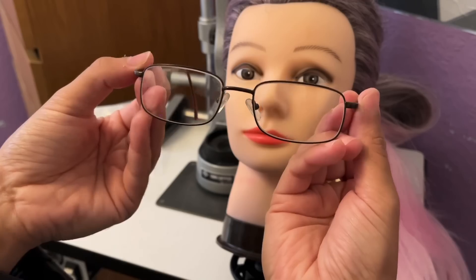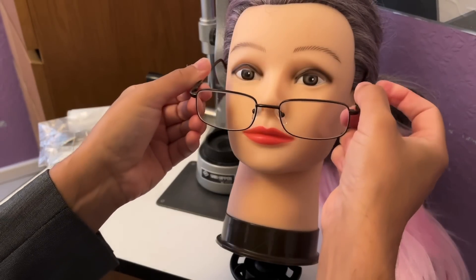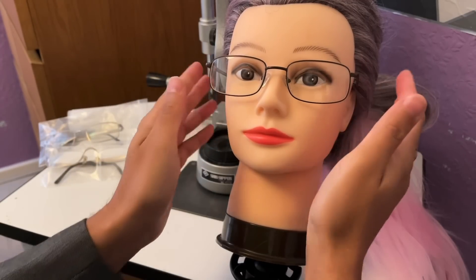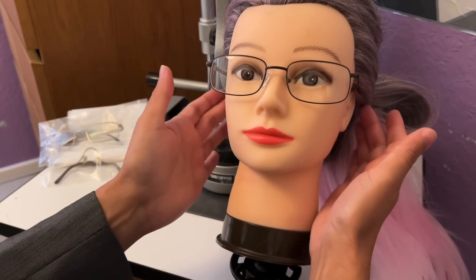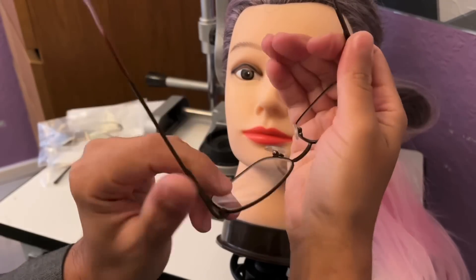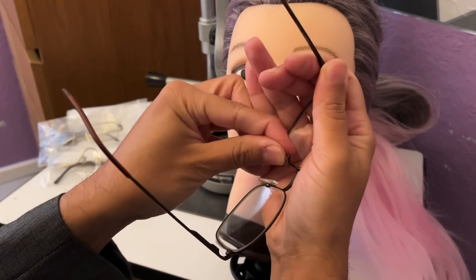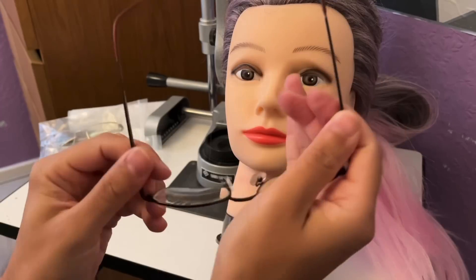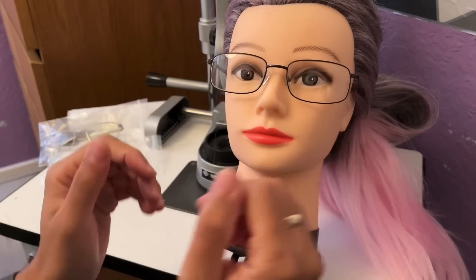This is what that looks like on the mannequin. As well as being able to adjust the length to bend, you can also adjust the pads so that they follow your nasal contours and thus stay in the correct position, as well as remaining comfortable on your face. That's what those would look like.